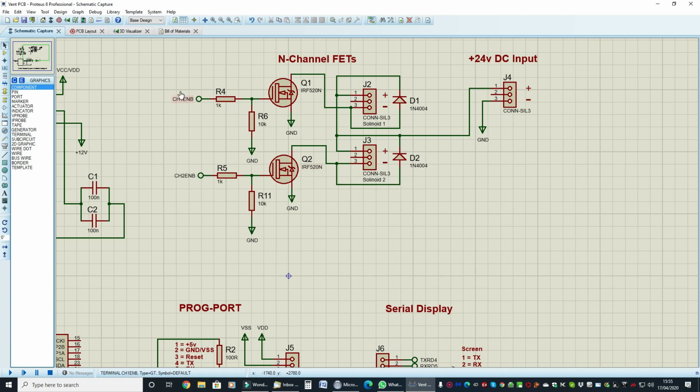Now this is the important part. This is the FET drivers for the solenoids. So you've got the FET1 here and FET2 here, which will be driven by the microcontroller. We've got some pull down resistors to make sure we have no false triggering. We have some blocking diodes here to stop reverse current flow. And we have a 24 volt DC input here to power the 2 solenoids, one for inhalation and one for exhalation.